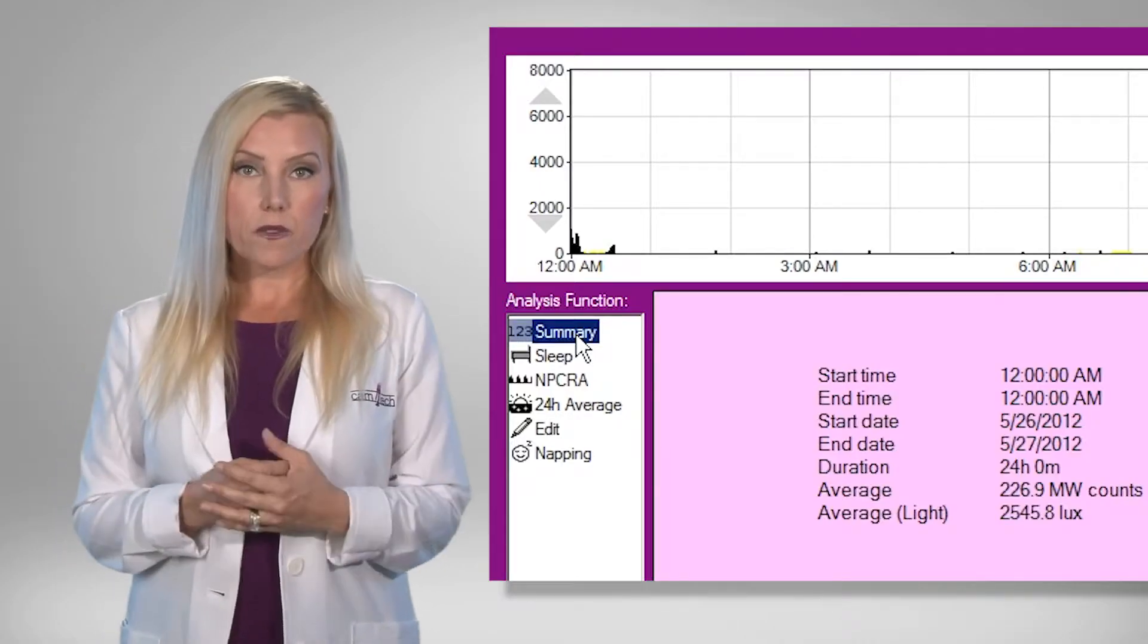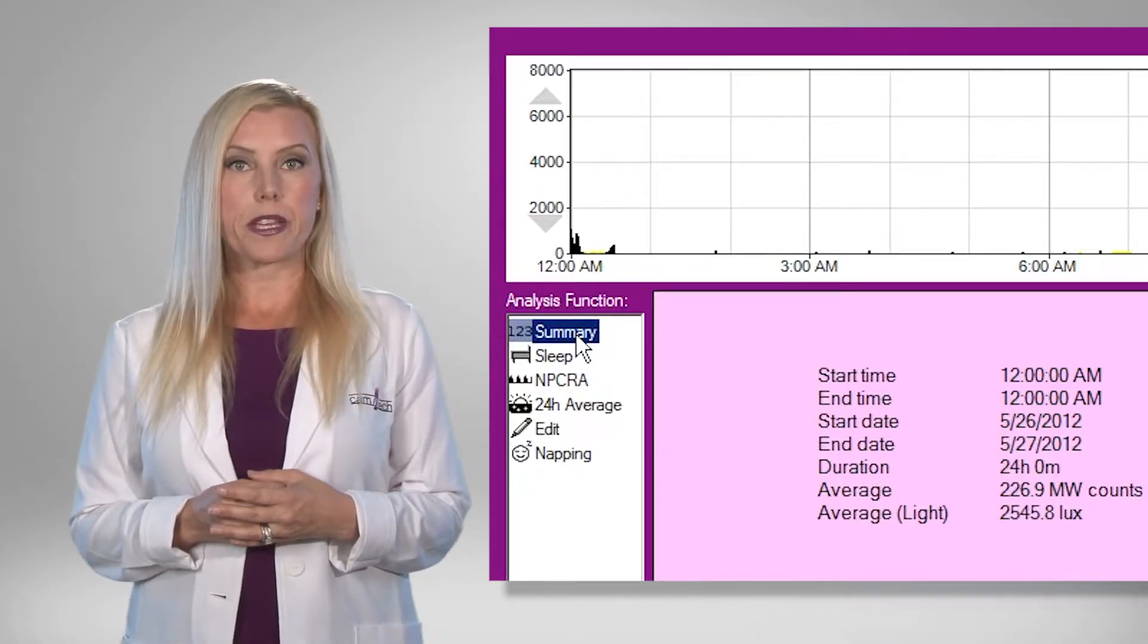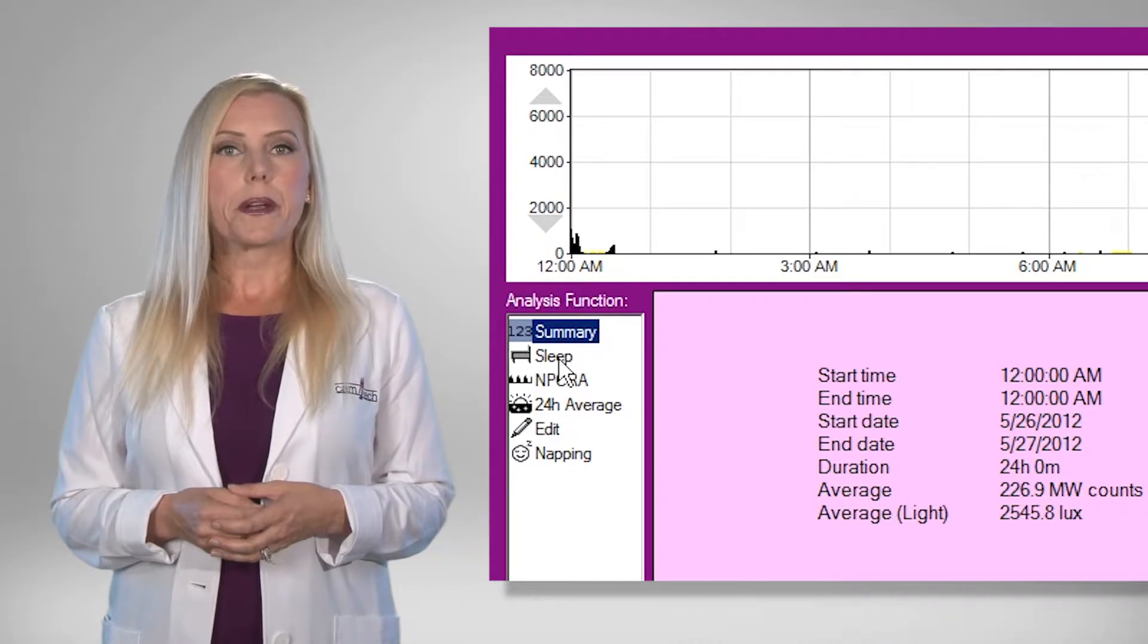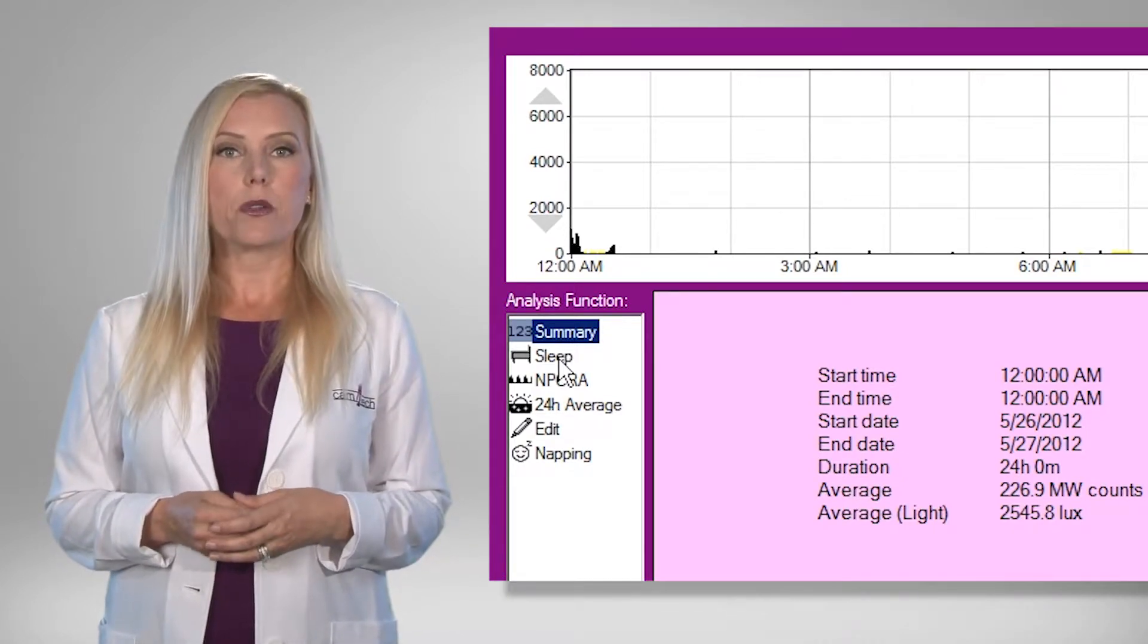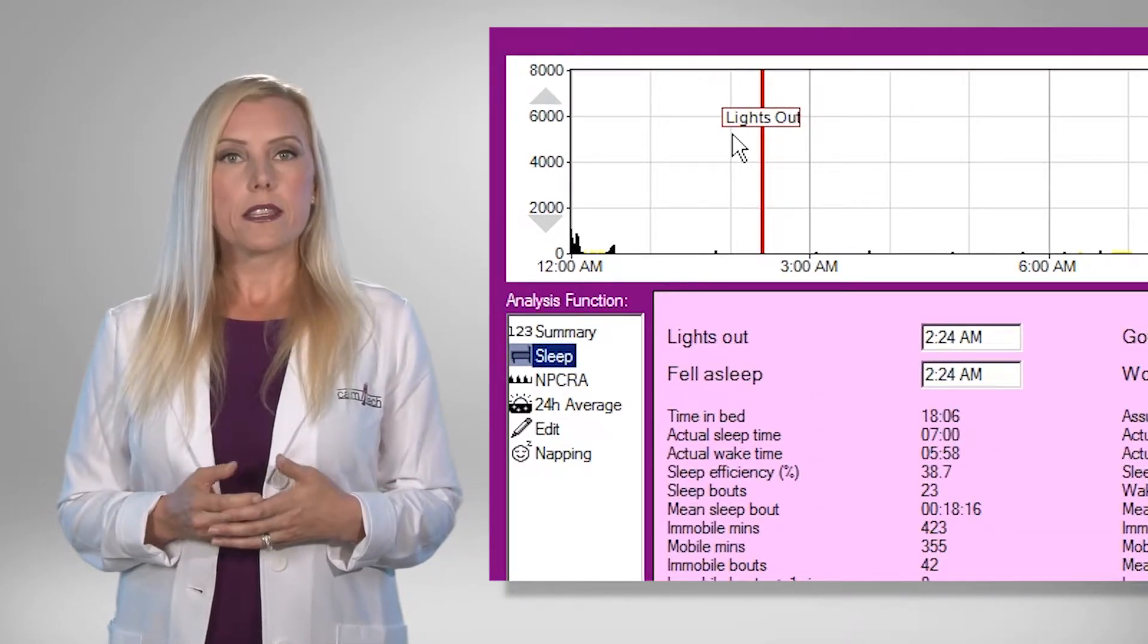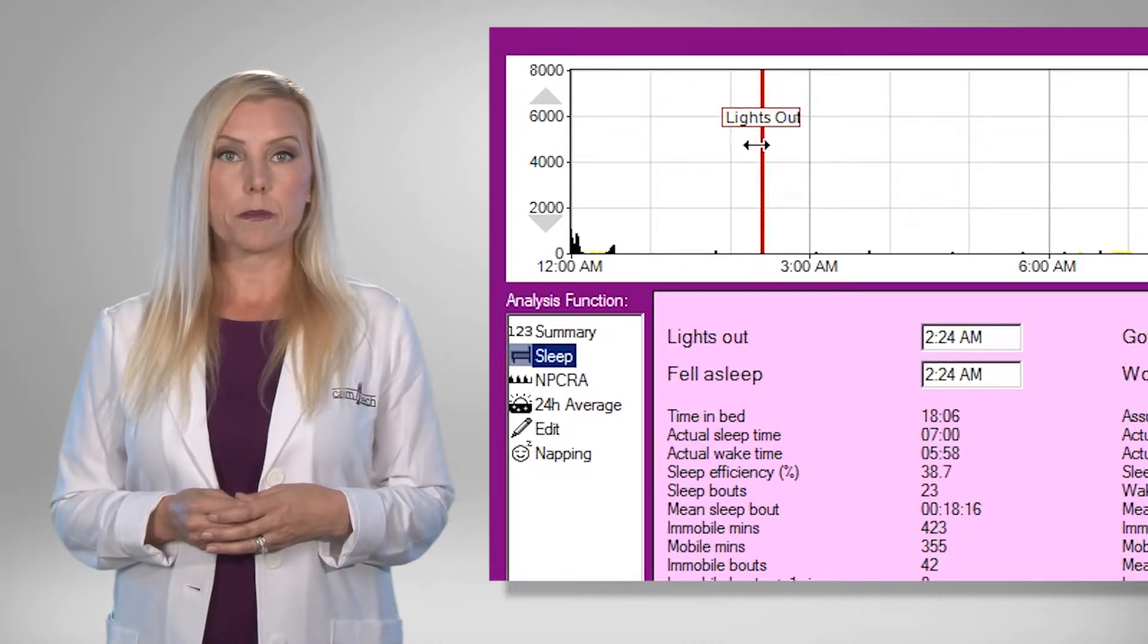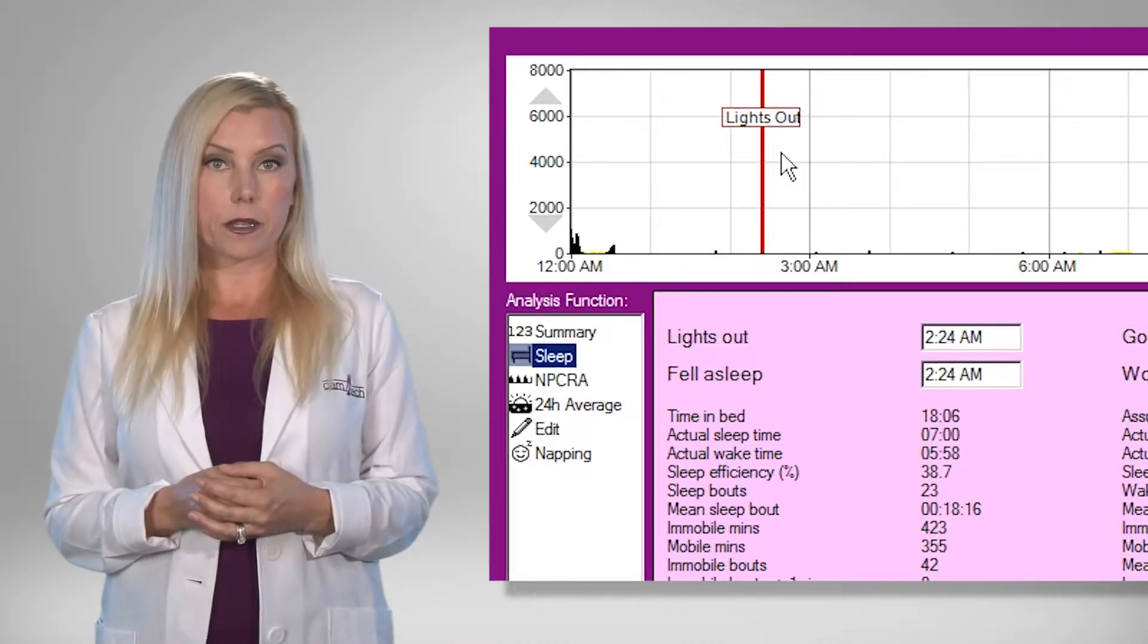The analysis functions allow the selected periods to be saved. These periods will remain highlighted in the motion-wise window and the analysis can be quickly reopened by clicking anywhere in the highlighted region.